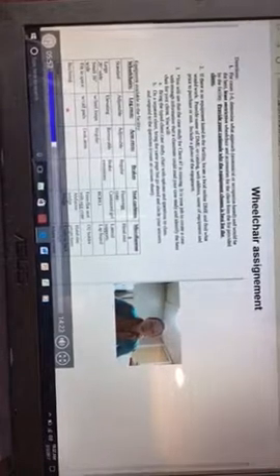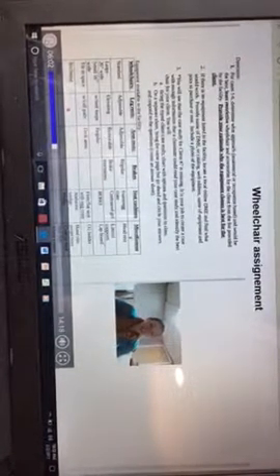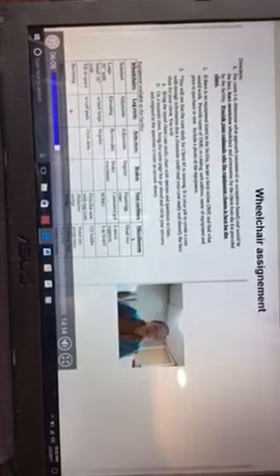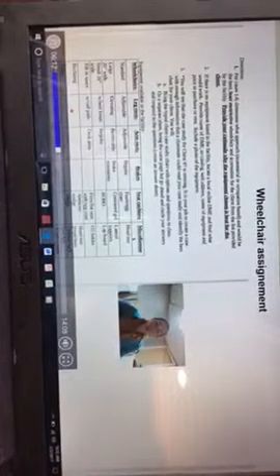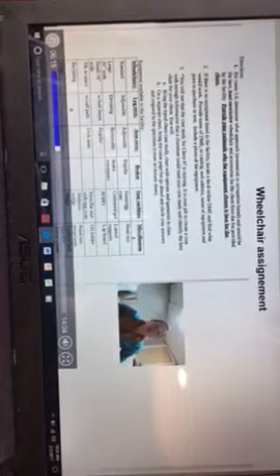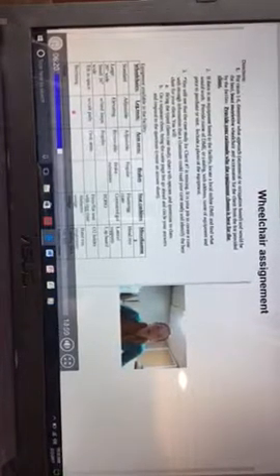When it comes to brakes, they're pretty straightforward. They're either regular or you have a brake extension for somebody who wouldn't be able to reach down very far or needs a visual reminder that they have brakes. Cushions. I get the most questions about the cushions, and the big issue with the cushions is they're so different. So here's my little walkthrough with some of the cushions.